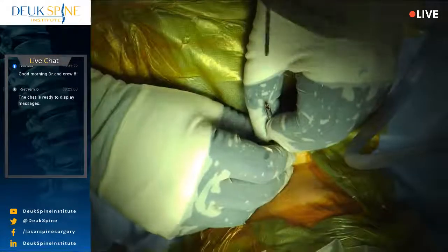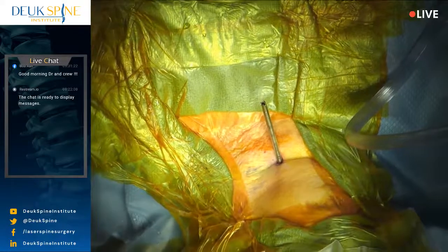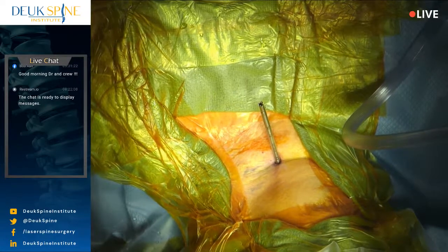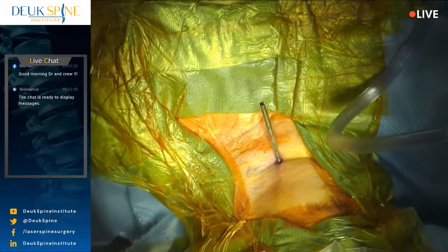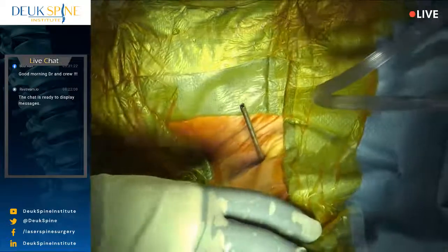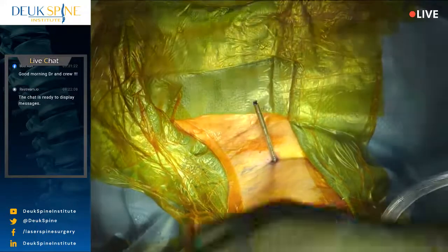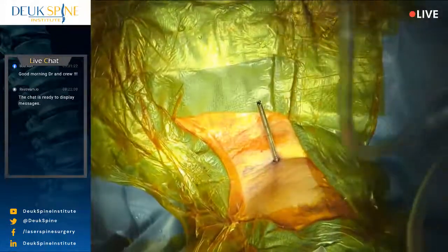Yep, keep going. So the dilator has been removed, just so you can all see what it looks like. It's basically a 3 millimeter cylinder that has a tapered tip. Okay. Now we're only doing one level today. A lot of times we're doing 2 or 3 levels, but this patient is a 1 level. Zach, why don't you run the video showing the Deuk laser disc repair animation so people can understand what we're about to do.